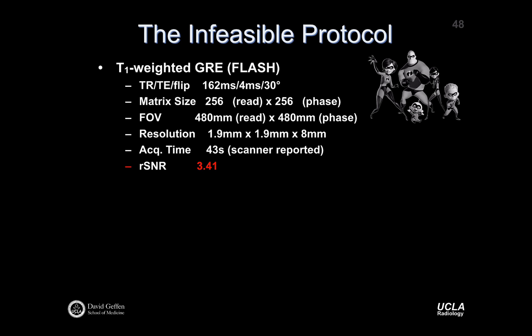It doesn't do Bloch simulations. It's not trying to figure out real signals and measure noise or anything like that. It's just giving you some insight that if you change a bunch of parameters, is that protocol likely to have better signal to noise or not compared to the protocol you start with. So this is the baseline setup. Does that seem fair? Does that seem pretty straightforward?